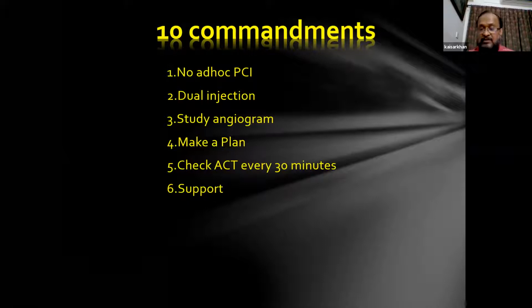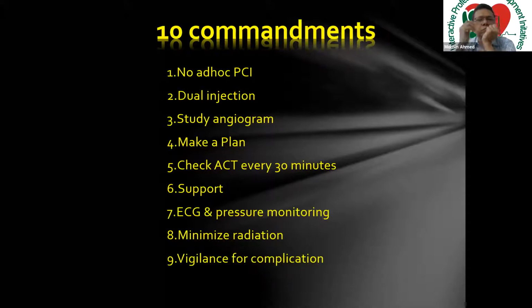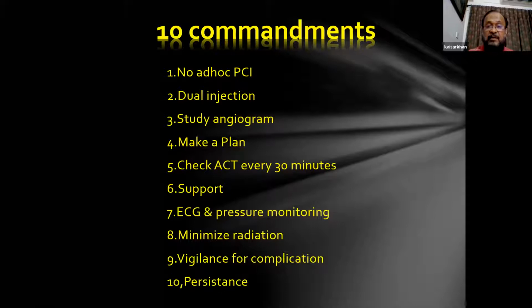Support like microcatheter, ECG and pressure monitoring. Sometimes there could be VT or ventricular fibrillation when you are in the false lumen or outside the intima, outside the vessel wall. Minimize radiation, vigilance for complications, and be ready. And of course, the last word, persistence.